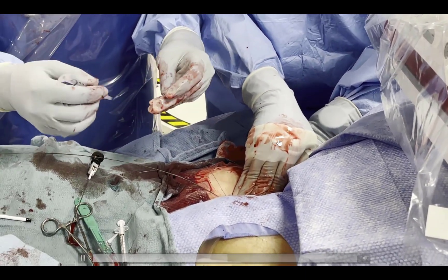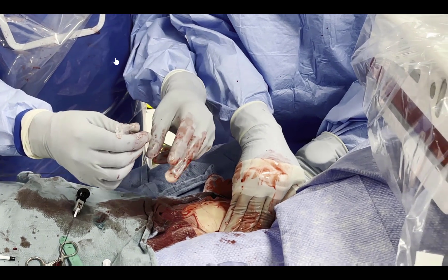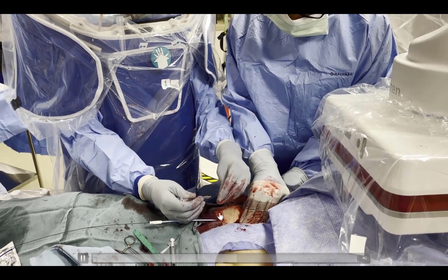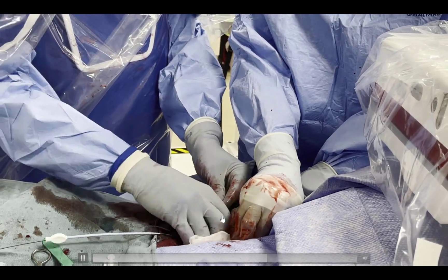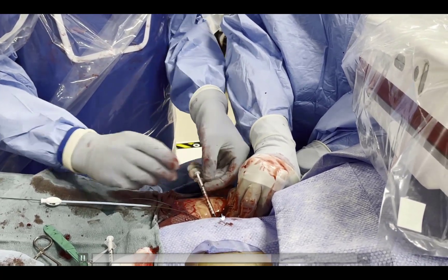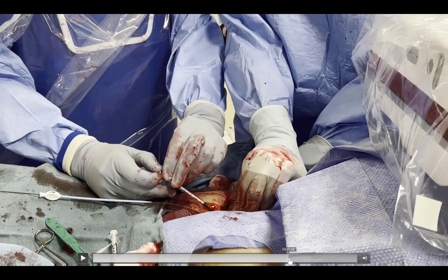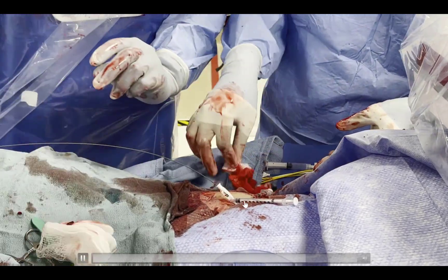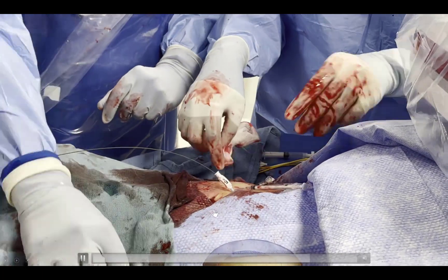Another way to keep the sutures organized is to use small insulin syringes. The sutures are inserted into a small insulin syringe, which keeps them organized — one syringe containing one of the sutures on one side, and the same thing repeated on the other side with the suture placed by the second device deployment. By doing this, we have the sutures nicely organized around the arteriotomy.